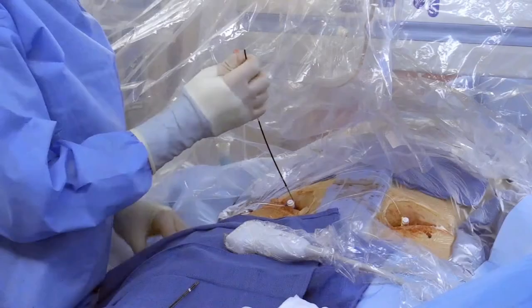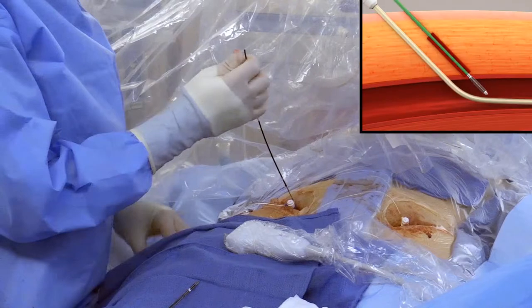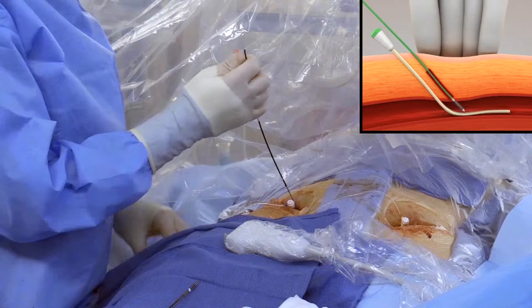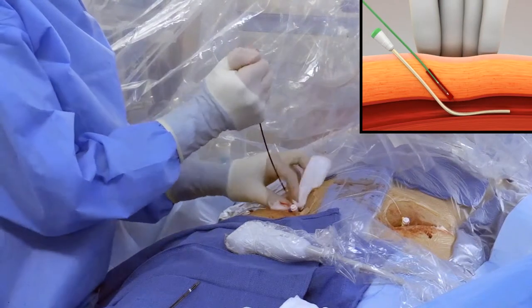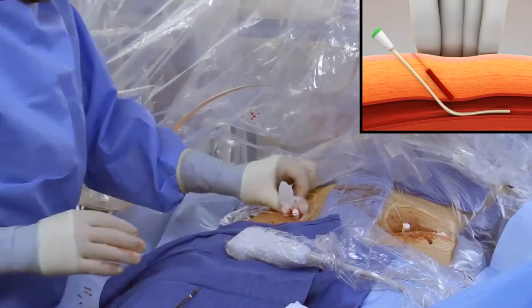To remove Vascade MVP, relax tension on the device and press down on the black actuator to collapse the disc. Apply gentle manual compression over the venotomy site. Gently remove the device.